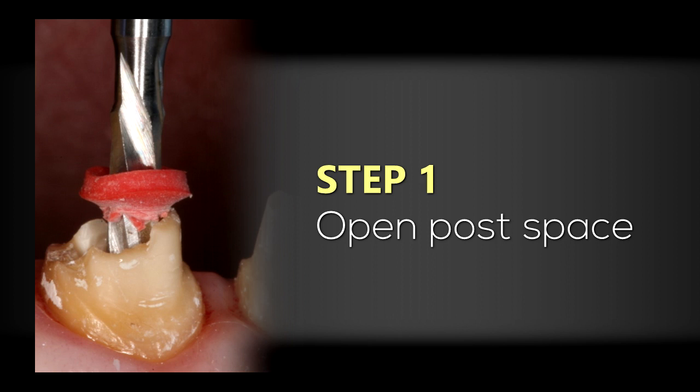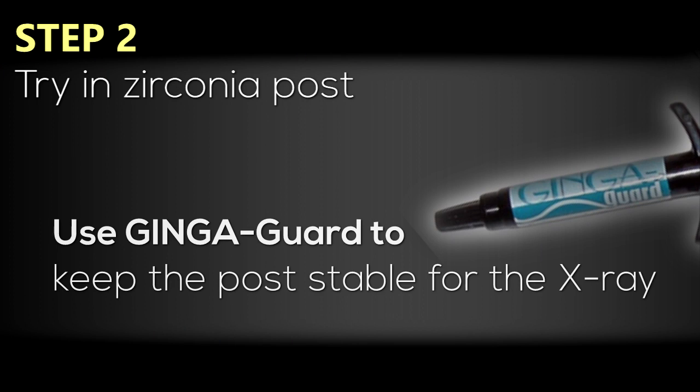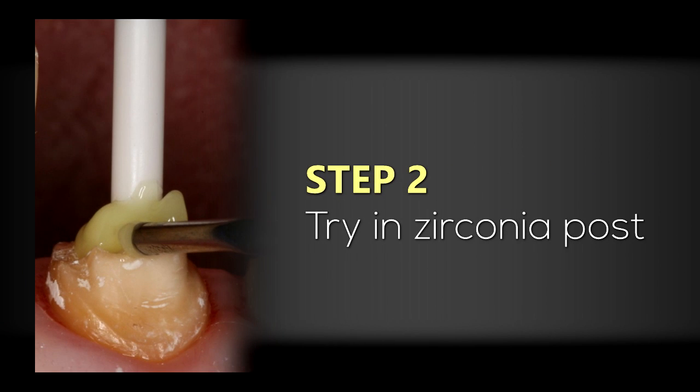First I'm going to be creating the post space. I will try in my ZirPost from Brasseler — this is a zirconia post. To be certain that the post doesn't shift or move while we take the verification x-ray, I'm going to be using a material from Cosmodent called GINGA-Guard. GINGA-Guard is essentially a liquid rubber dam material. I'll apply that around the post onto the tooth structure and light cure it for 10 seconds. This material maintains its flexibility but also adheres slightly to the tooth structure, keeping the post stable during the x-ray.